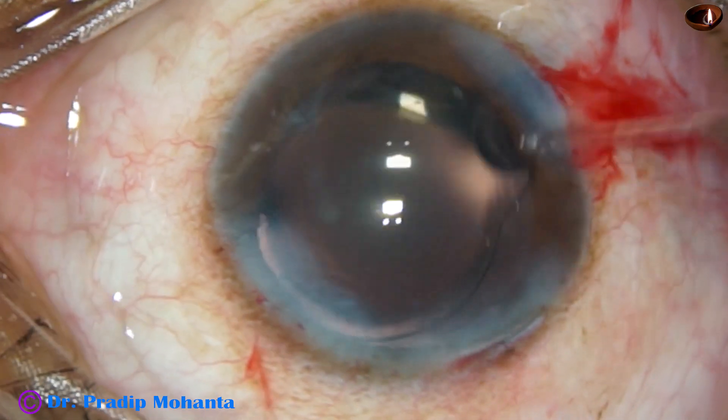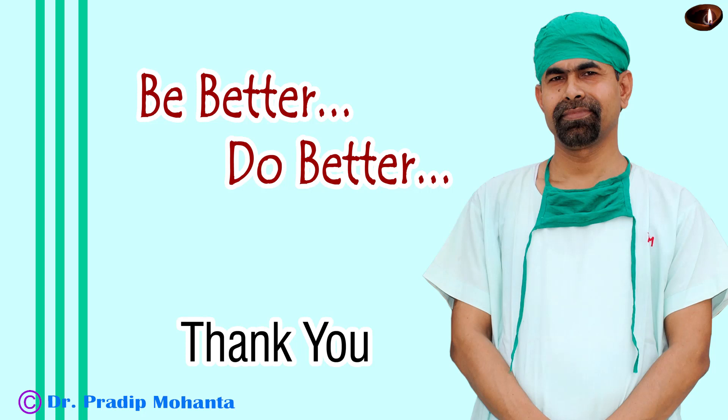The anterior chamber is nicely formed and the case is concluded. Thank you very much for your attention. I hope this video will help you in developing your surgical skills. Be a great surgeon and serve your patients, serve mankind with love, respect, empathy, and great surgical competence.